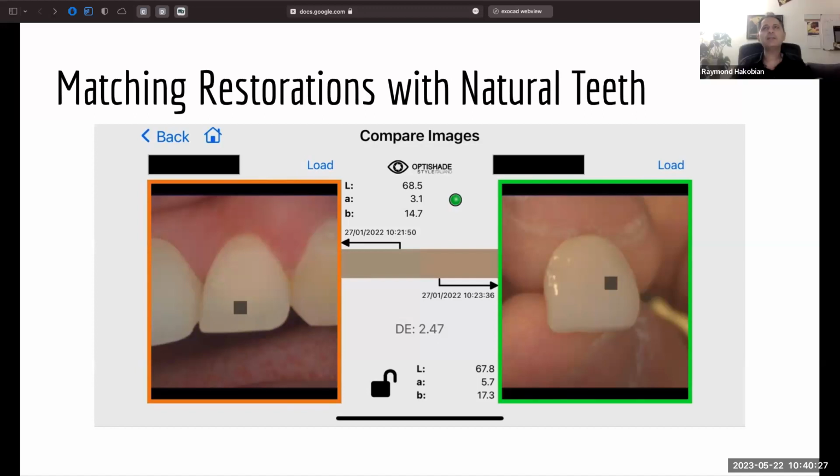Actually, Matisse gives you a map. That map helps you to layer the ceramic onto the zirconia crown, or lithium disilicate, or whatever. They have a chart in their software. That chart helps you choose what kind of zirconia crown you want to use, what type, what translucency, and what kind of porcelain you have to use to get that shade matching.